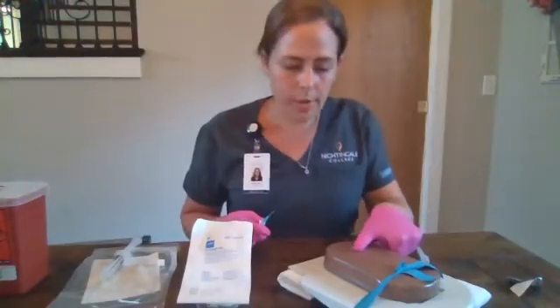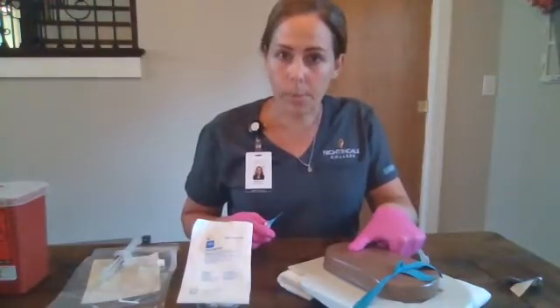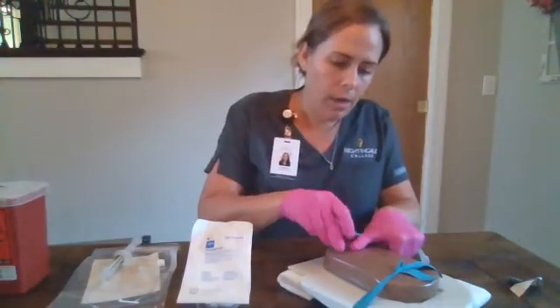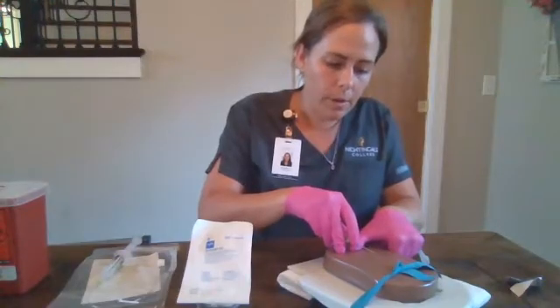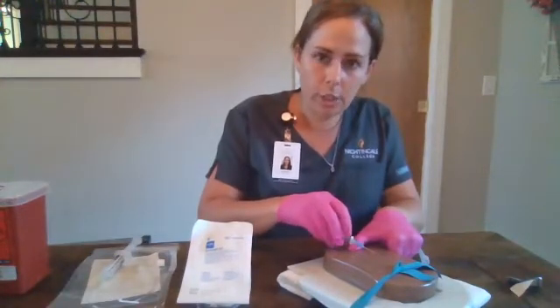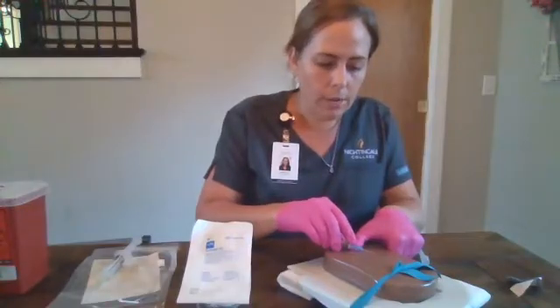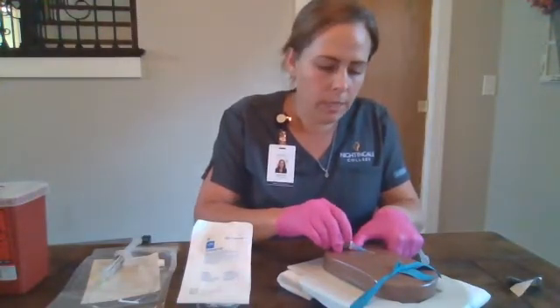We are going to anchor our vein down. We are going to pull the skin a little bit taut and we are going to insert our IV catheter bevel up. We are going to advance it until we get a flash in the chamber. We're going to lower our angle slightly and advance it another quarter inch to ensure that the catheter makes it into the vein as well.